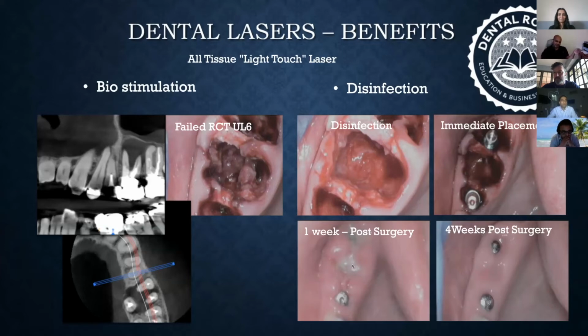And why I say the laser does it is because the disinfection part is very clear to see. There's proper pictures, we can see it absolutely fine. But what the laser does, which we cannot see, is the power gets seeped into the surrounding tissues. Most of the power goes onto the top, but it doesn't stop there. There's some amount of power that slowly seeps into the surrounding structure, and that seeped power is like charging a battery of your cell. Okay, that cell gets charged up, and that reparative process of the cell increases by multiple folds, and it minimizes the amount of inflammation.